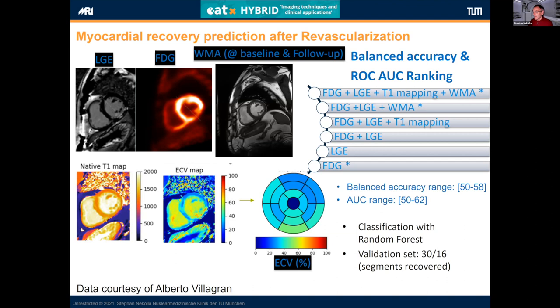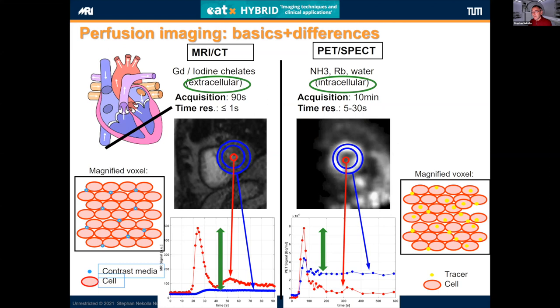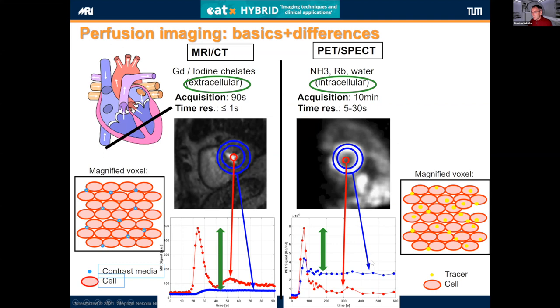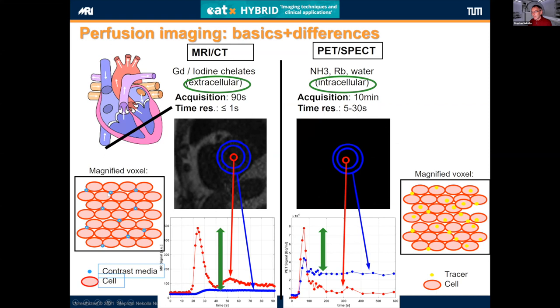The other extremely interesting project we did is a simultaneous injection of MR contrast agents and perfusion agents. Because in the end, you see this here in red, this is the blood input function. In blue, you see the tissue curves. Nuclear has a very high sensitivity in the sense that we target the complete cells, whereas the MR community is able to go basically only for the spaces in between the cells.